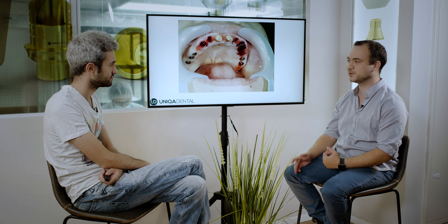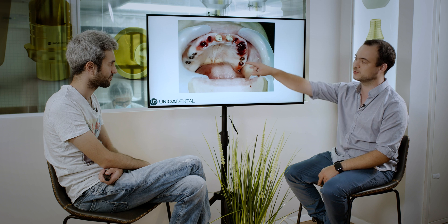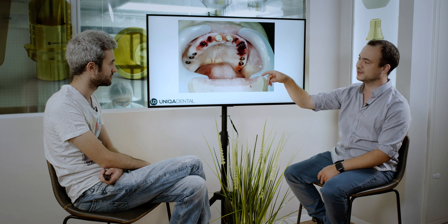What we chose to do is to extract those teeth and leave for now the two central incisors. For the provisional bridge — the temporary restoration — you want to make the restoration on those implants. But you can't make a horseshoe like this without any anterior support; it will just press on the gingiva and on the implants and can harm the implants installed above this bridge.